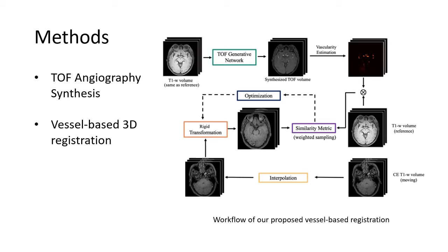This workflow is flexible in that it can be applied to different types of moving images, that is different types of registration tasks, like contrast enhanced T1 weighted, PD, TOF, or SNAP in the same scanning sessions, or the other T1 weighted images from another time point of the same patients.